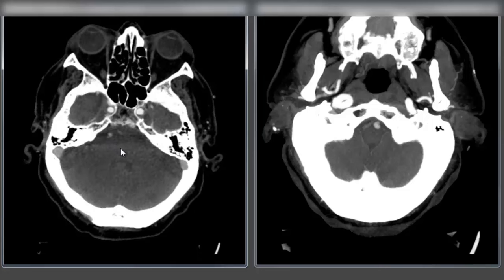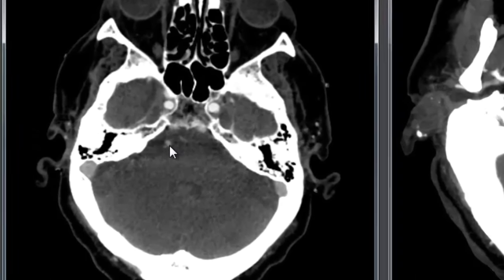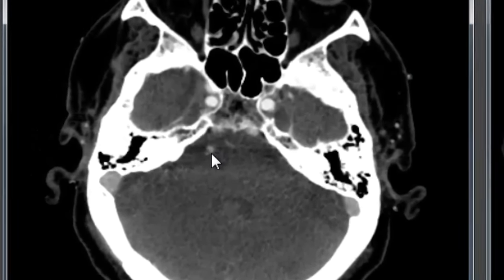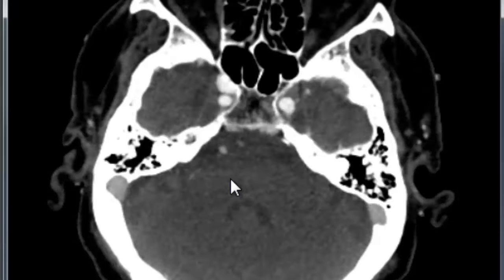We can already see one pretty notable finding before we even get to the level of the occlusion: the degree of contrast opacification here is noticeably lower than you see in the internal carotid artery on both sides as we come up.